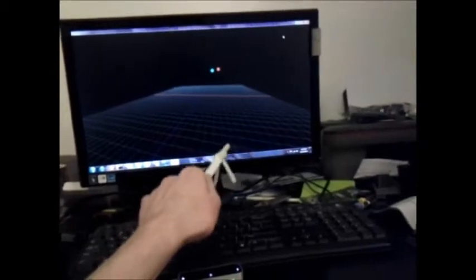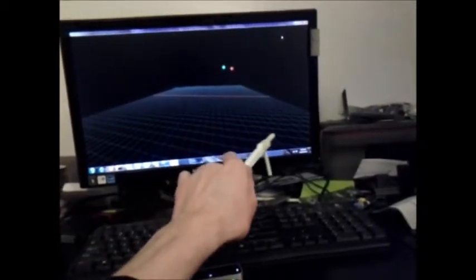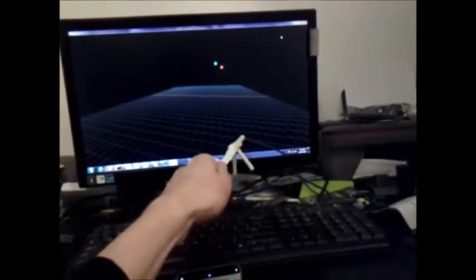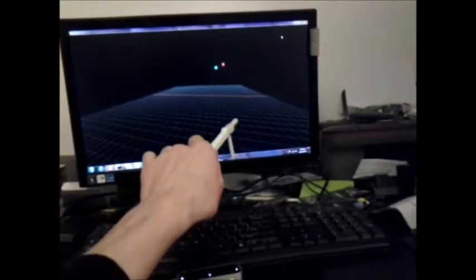When the palm is in view, this method works fairly well as the palm is large and easy to locate. The obvious downside is that in a real surgical setting, the palm will not always be in view. When the palm or either of the attachments are out of view, this approach fails.